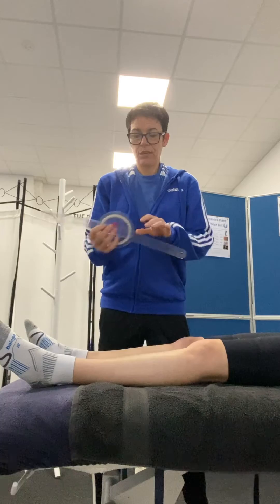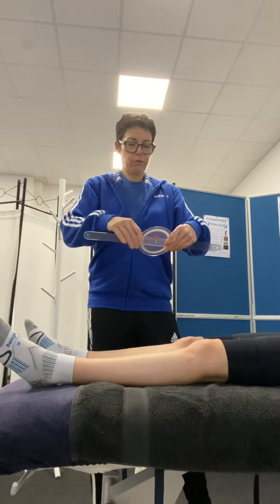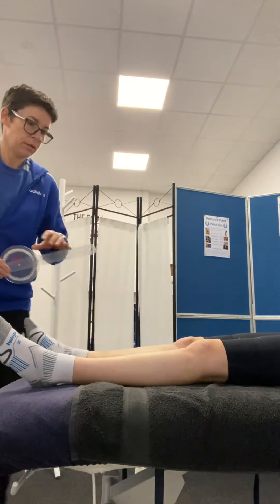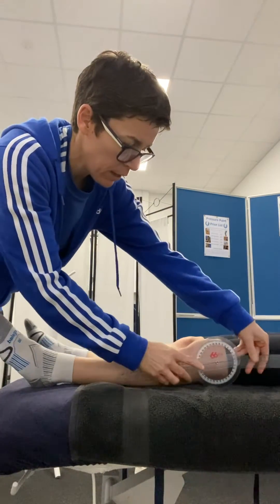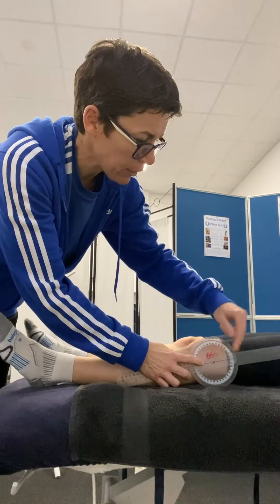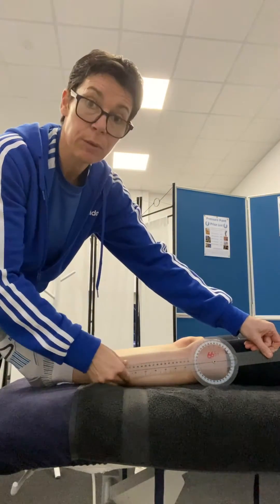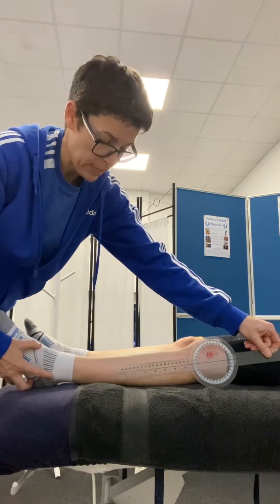The other way for knee extension — a bit more accurate but a bit harder to do — is to place the pivot of the goniometer right through the lateral knee joint line. Then one arm of the goniometer heads up to the greater trochanter, and the other arm heads down to the lateral malleolus.